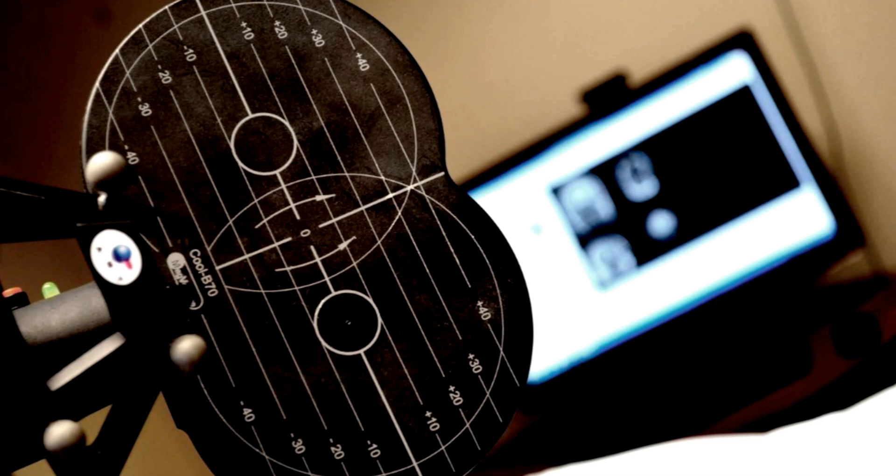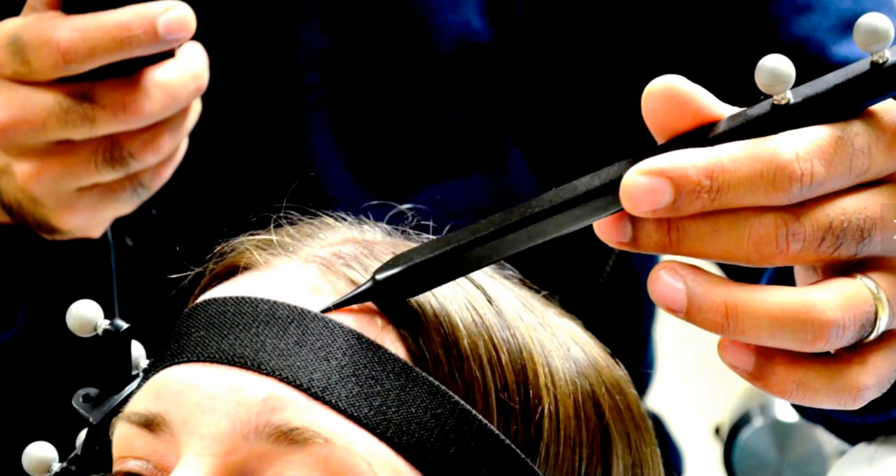The device is an electromagnet that generates a powerful but finely focused magnetic field, as strong as the one in an entire MRI scanner, but focused into an area about the size of a dime. It's powerful enough that if you place it over the area of the brain that moves the thumb and apply a few pulses of stimulation, you will actually see the person's thumb move.